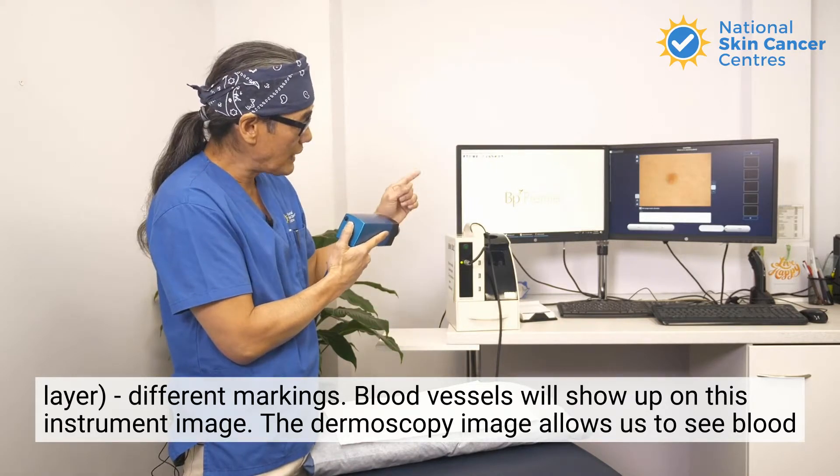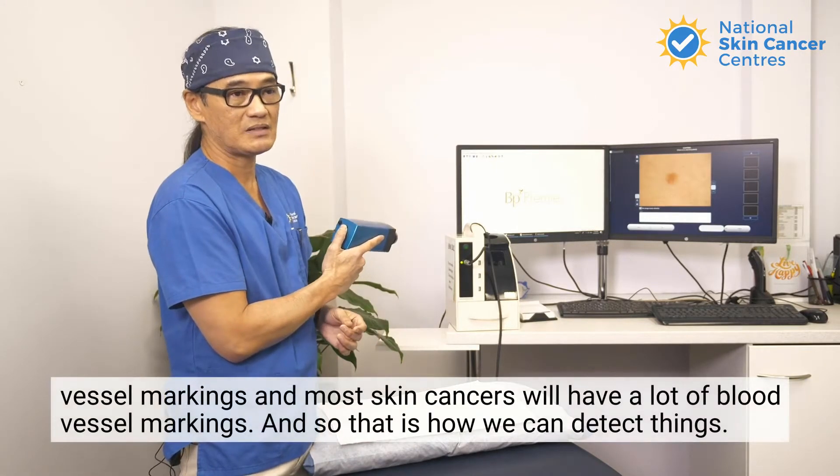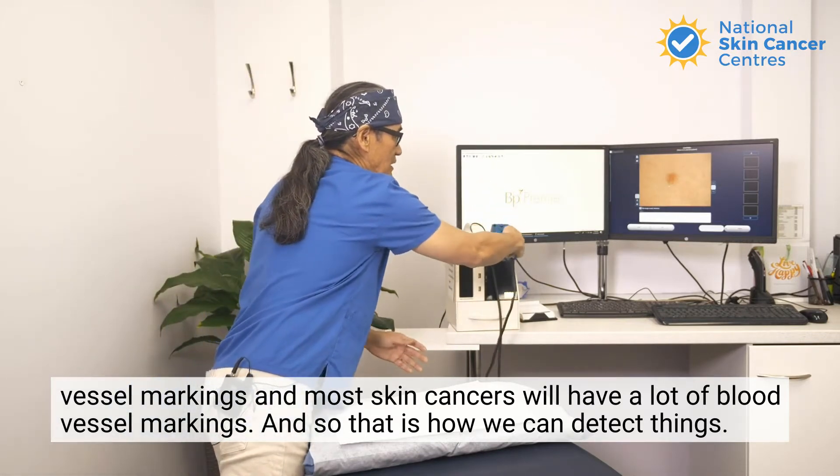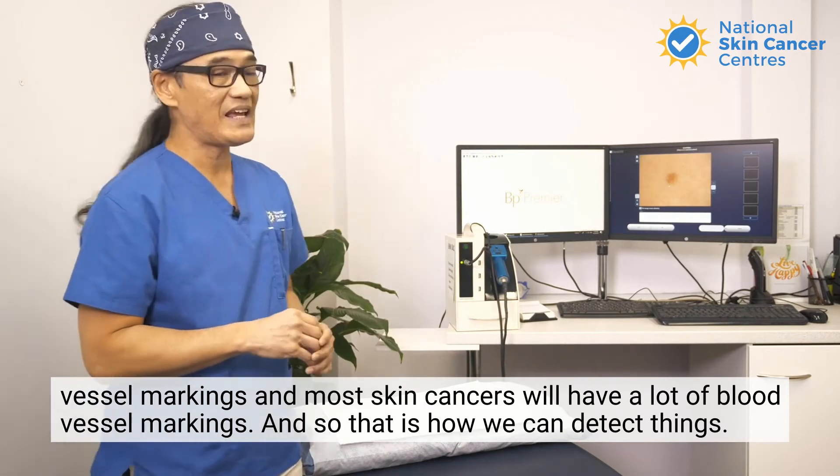The dermoscopy image allows us to see blood vessel markings, and most skin cancers will have a lot of blood vessel markings. And so that is how we can detect things.